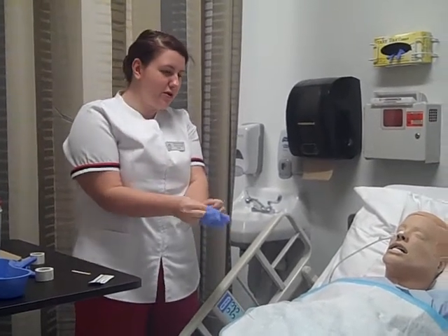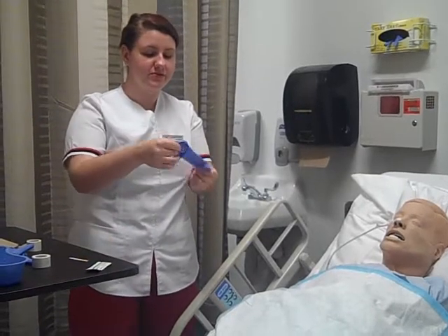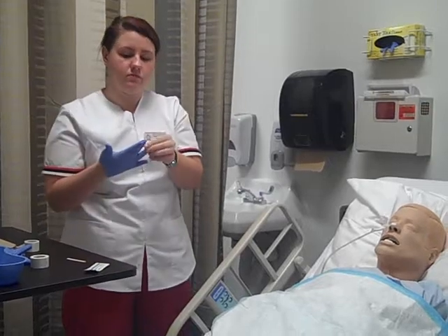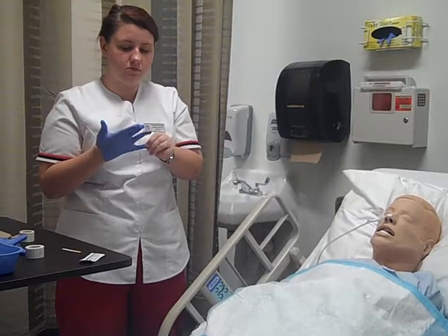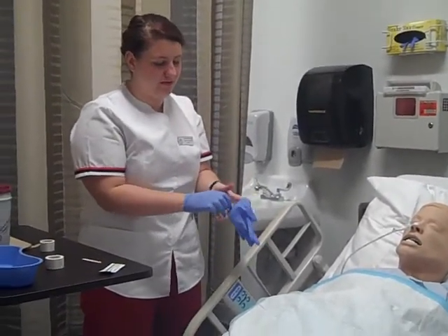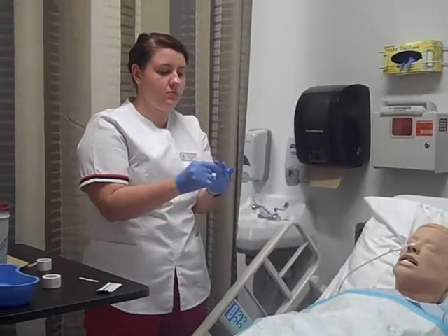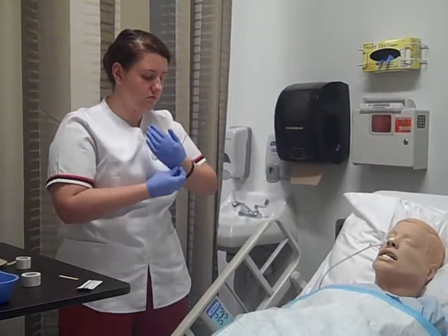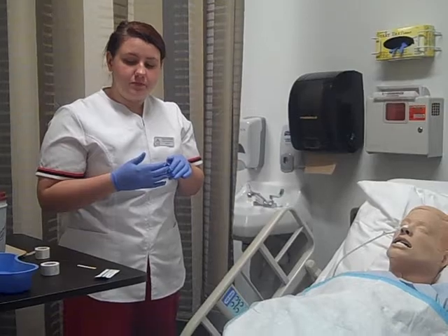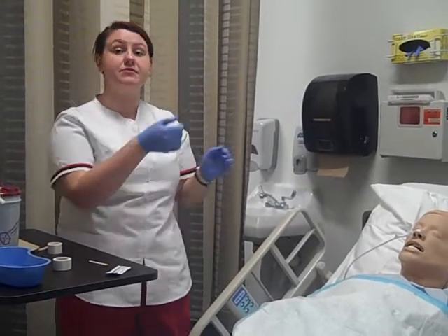How are you doing today, Miss Amy? Good. Sounds good. Okay, Miss Amy, I'm here to remove your NG tube. Before I remove it, I'm just going to check to see if it's not up to suction. If the NG tube was up to suction, I would turn the suction off before I removed it.